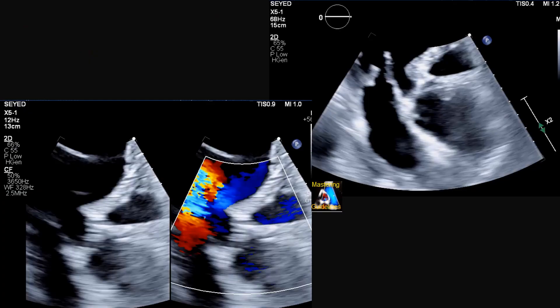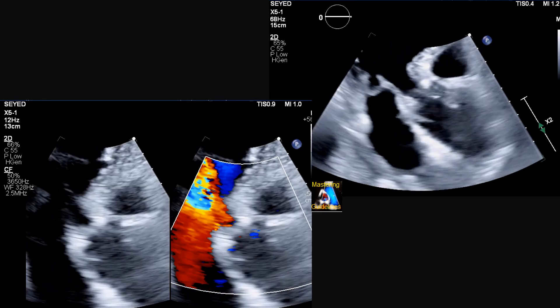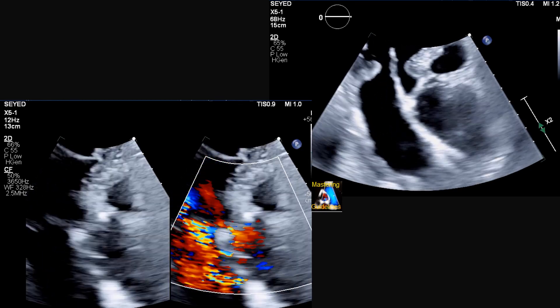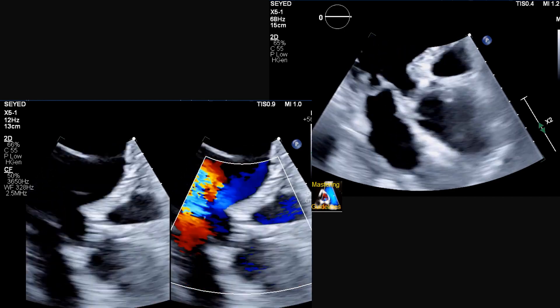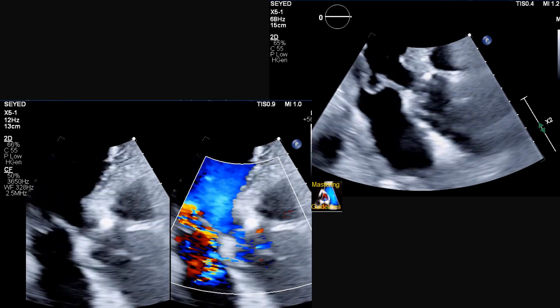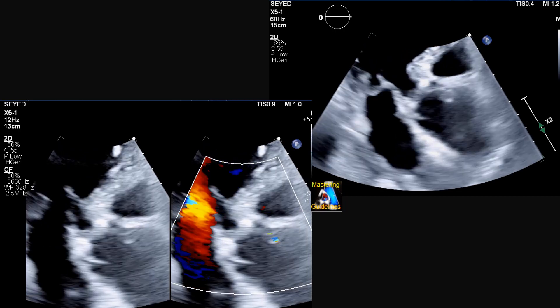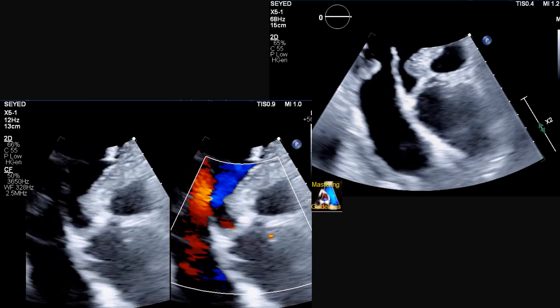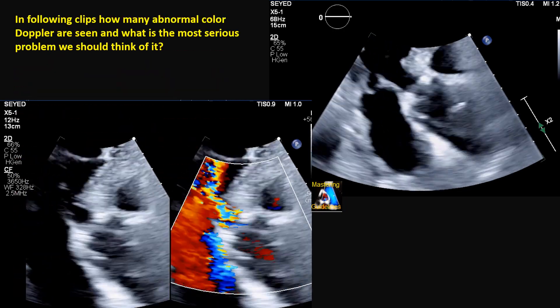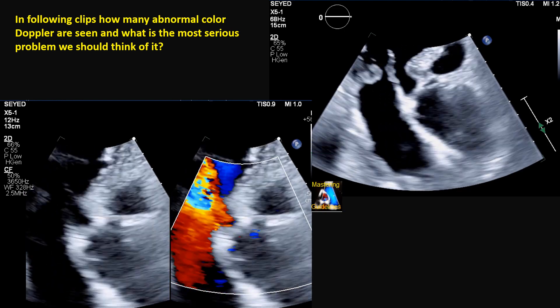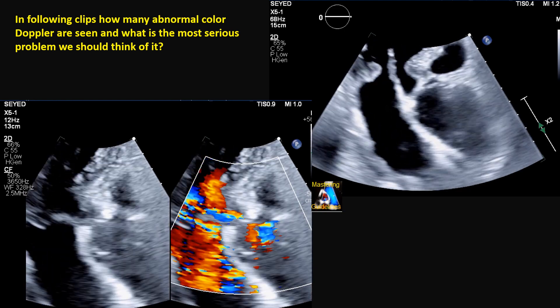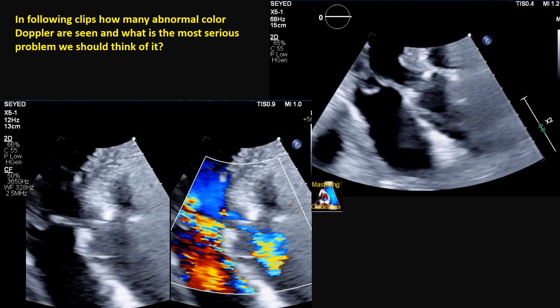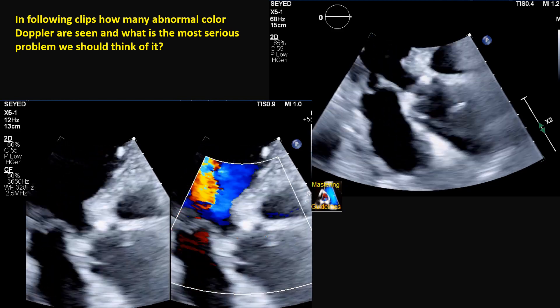Here we have another case. As you can see, this is a 2D image — slightly wider — and this is the color Doppler. How many abnormal color Dopplers can you detect on this view? And besides that, based on all the findings, what is the most serious problem we have to consider regarding this finding?